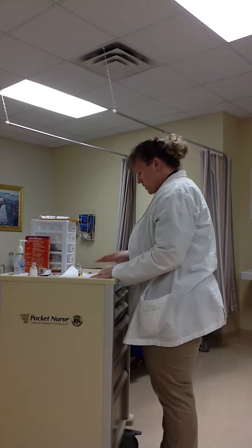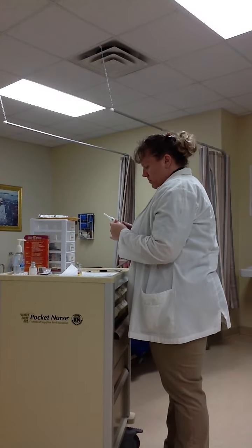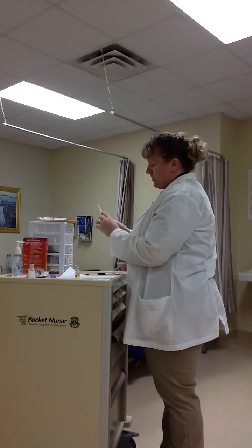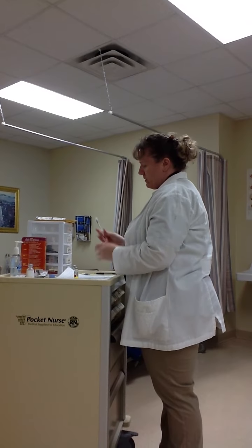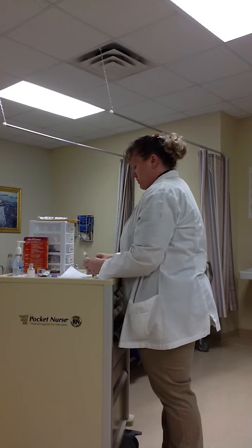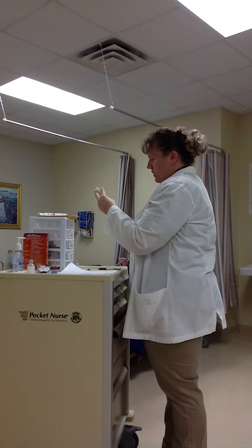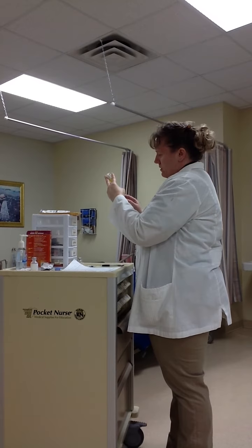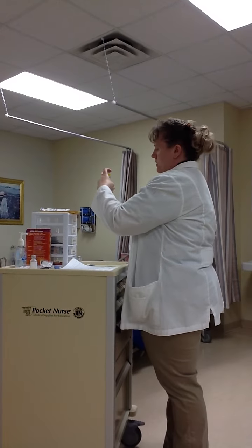I know that this is an intramuscular injection, so I will have to pull out the correct needle and syringe. I have pulled out a small 3 ml, which gets me to 0.5 mLs. I'm going to pull that back. Make sure that I wipe off again since I have been in this several times. Bring it back up. Pull back to my 1/2 mark. Get rid of any air bubbles that I may see. Show that to my instructor.